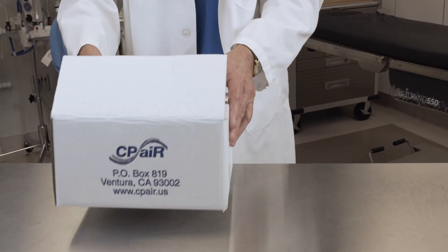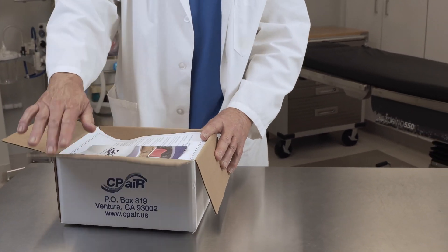So what is the PAL? The PAL is a CPR guidance device that gives any person the guidance and direction to perform this life-saving procedure.